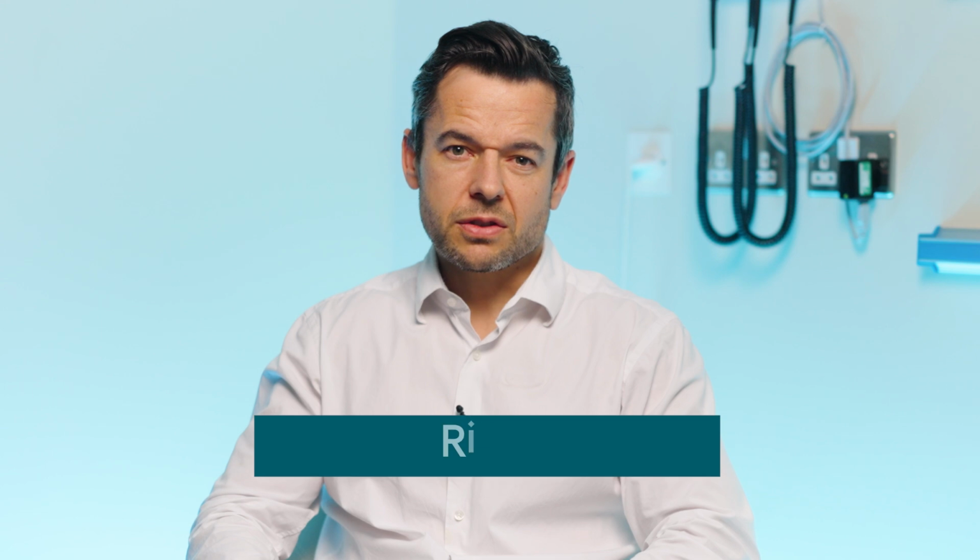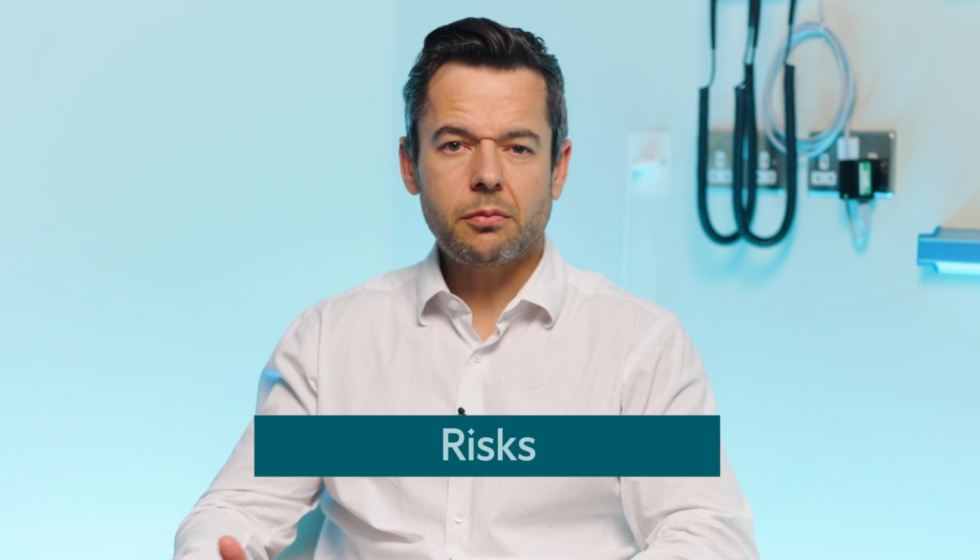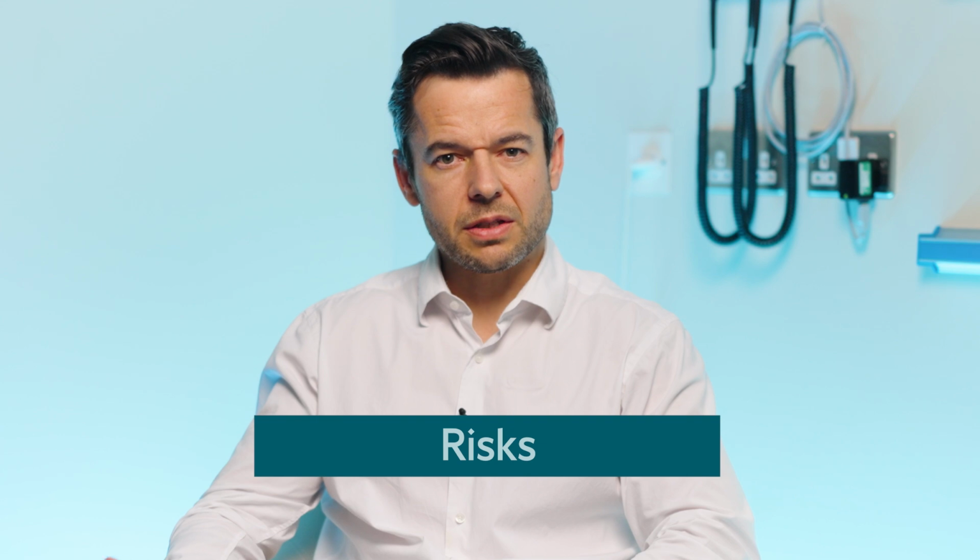The main risks of a flexible cystoscopy are that it can be uncomfortable. There's a likelihood of getting some blood in the urine, usually just a small amount in the days after the procedure. The risk of infection is about 1 in 50, so we don't normally give antibiotics, but they can be given if there's a particular concern. And if we find any abnormalities, that may go on to necessitate further tests or treatment for the patients.